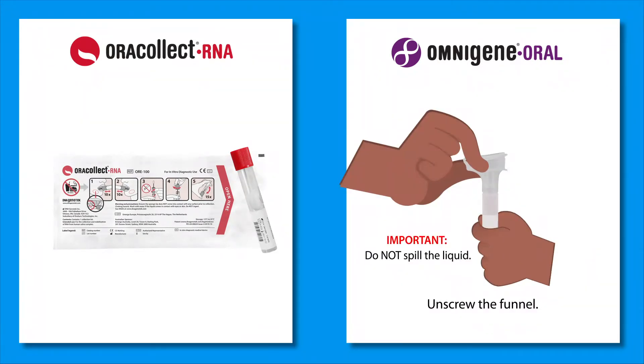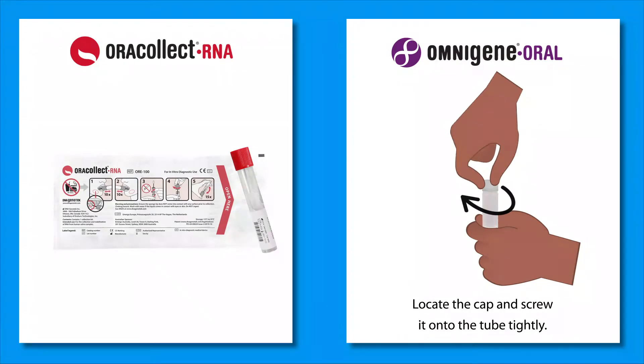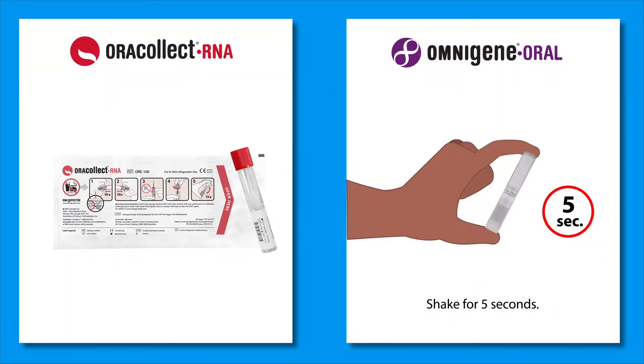Unscrew the funnel. Locate the cap and screw it onto the tube tightly. Shake the tube for five seconds.